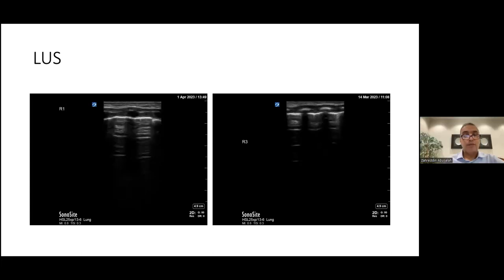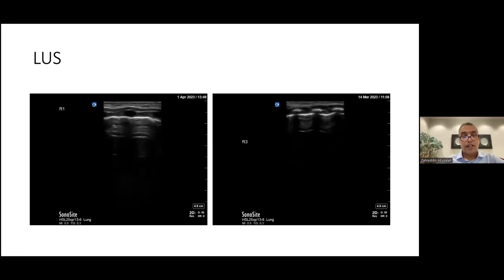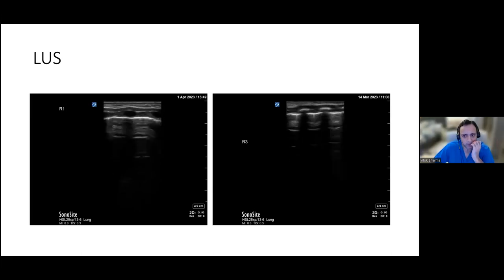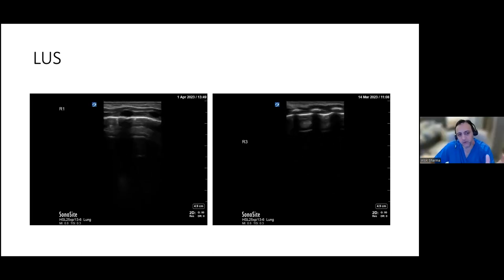So you're using a Sonosite. Do you have an i-gain function? There is a gain function, yes, on the side of the screen. But do you have an auto set? You can still play with the gain, but it's usually a preset setting. You choose. So what you can do with the preset setting, and again, very happy to have a call, is sometimes preset settings don't allow you to change.